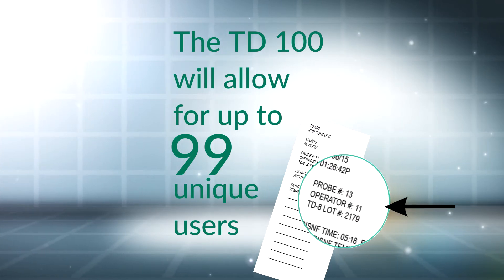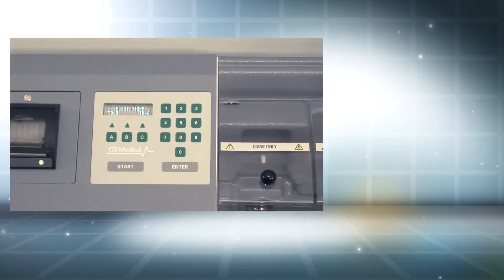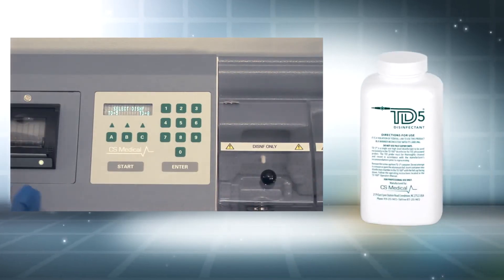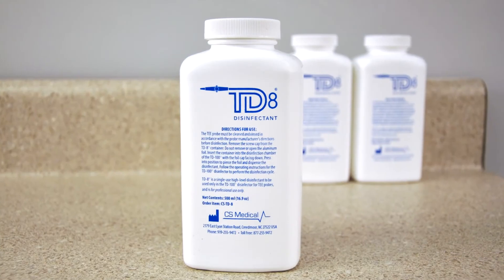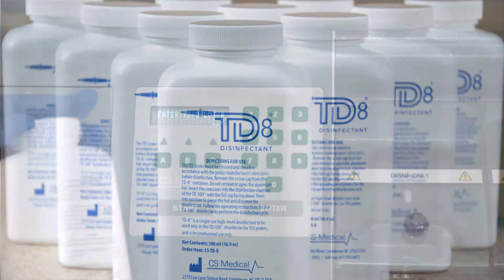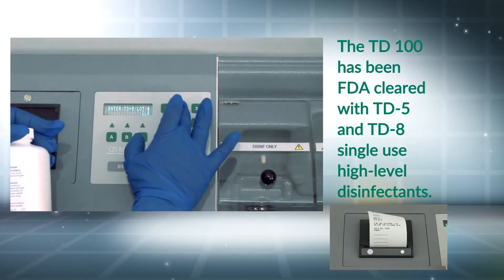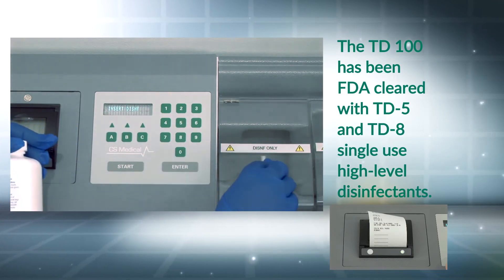The TD100 will accept up to 99 operator numbers. CS Medical offers two single-use high-level disinfectants for the TD100: TD5 and TD8. The disinfectant type will be printed on the verification ticket along with the lot number, contact time, and average temperature during the disinfection process.